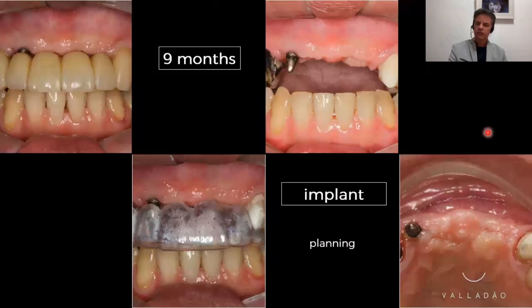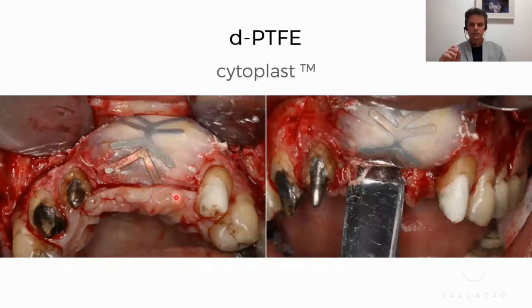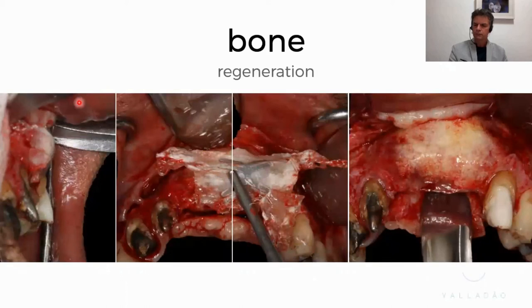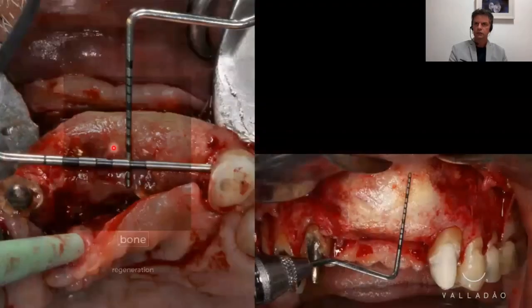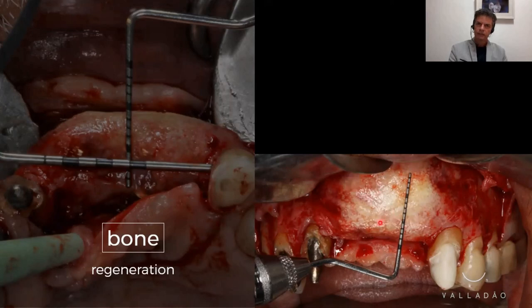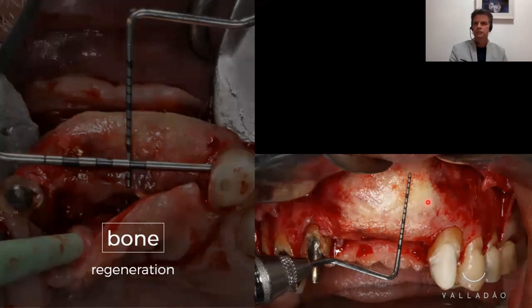These are the clinical evaluations at nine months. Everything is going well, so we proceeded with virtual planning of the implants. I'd like us to take a look at the appearance of the membrane before its removal — everything seems to be fine. Observe the bone volume in both the horizontal and vertical aspects. The titanium mesh appears to be printed into the bone, the bone really looks vital, and there was no soft tissue between the membrane and the bone. A nice amount of bone regeneration was achieved.